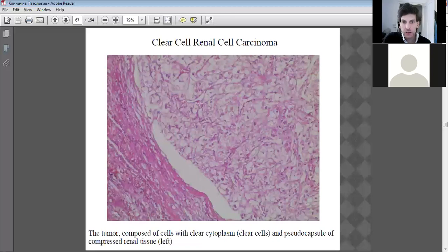The spaces forming within the tissue are interesting as well. Fairly clear cytoplasmic spaces, as you can see there. It almost looks like the tumor has holes in it, but it's clear cytoplasmic areas. Because the tumor is rapidly dividing, there's less ability or chance for development of cellular structures inside the cells.